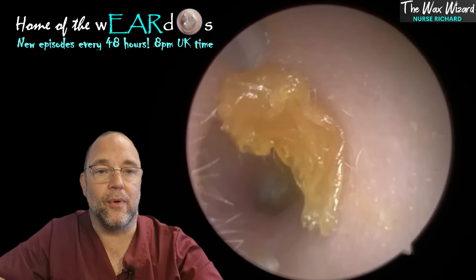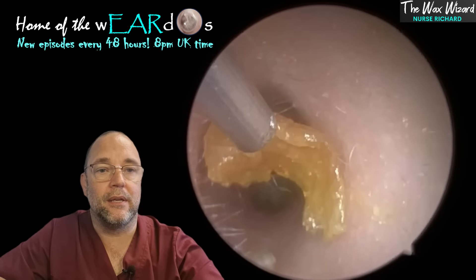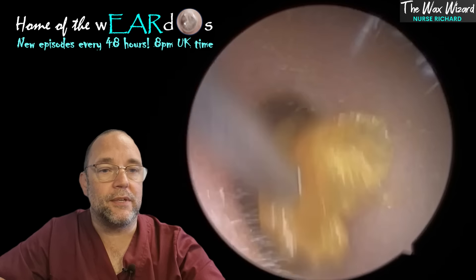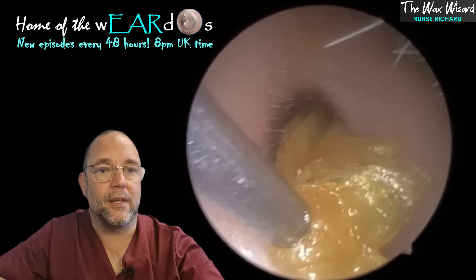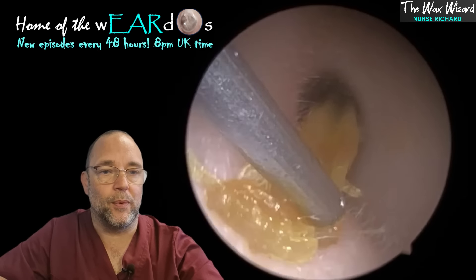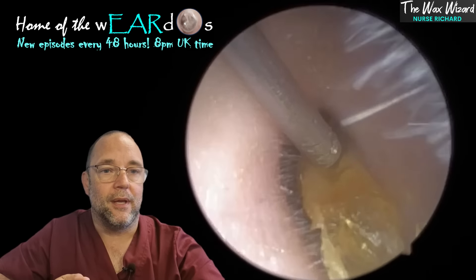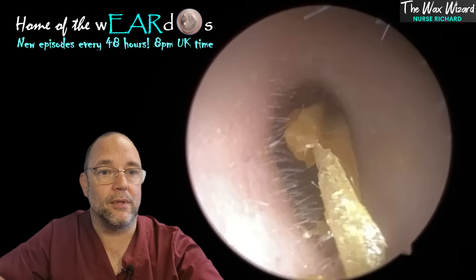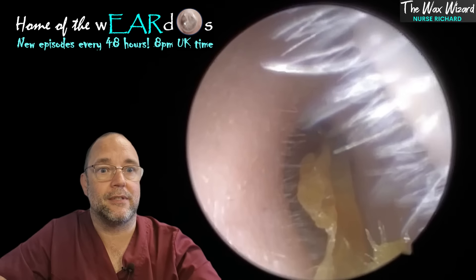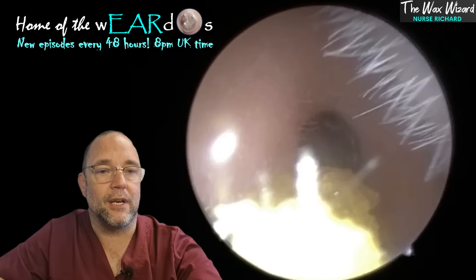This lady — I think the other ear of this lady was in the previous video — and she fully admitted to wedging everything in there with a cotton bud. As you can see, she's done the same thing on this side as well. She's been really lucky because she's really pushed it down deep. When it came out, I thought we might get lucky and get a really long ribbon of skin, and it was relatively long. It's quite difficult to film when you're kind of halfway out the ear, because you're more really doing it with the naked eye, not so much with the endoscope. It's kind of a bonus if you capture it on camera.